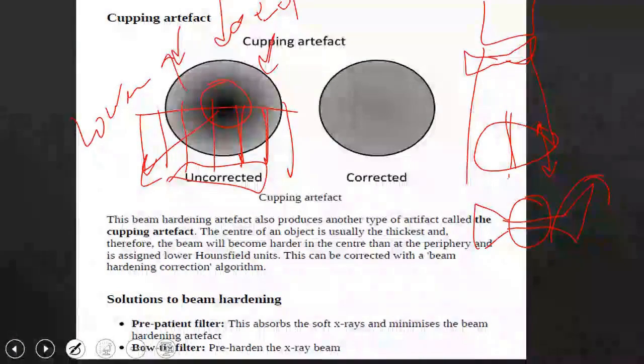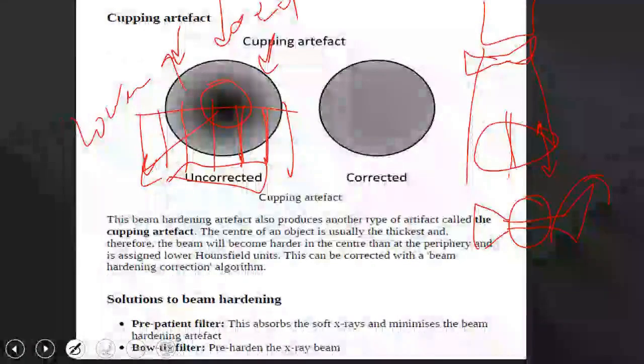They ensure that all detectors, whether in the periphery or in the center, such as the right periphery, center, or left periphery, are receiving the same signal with the same intensity and displaying the same Hounsfield unit on the existing image.